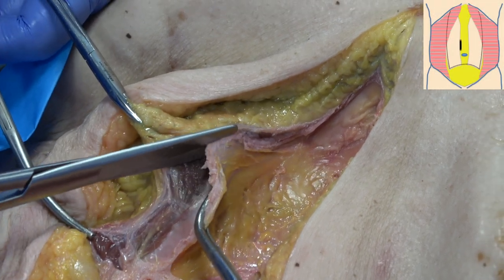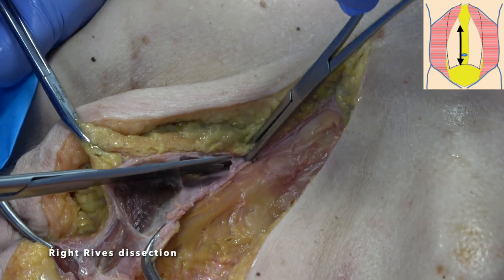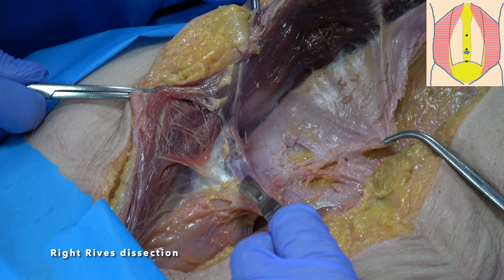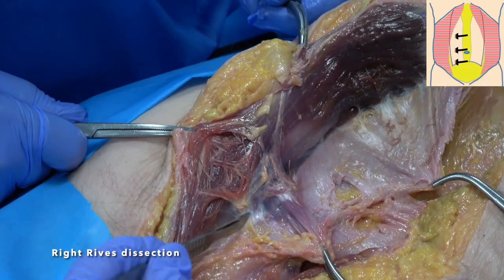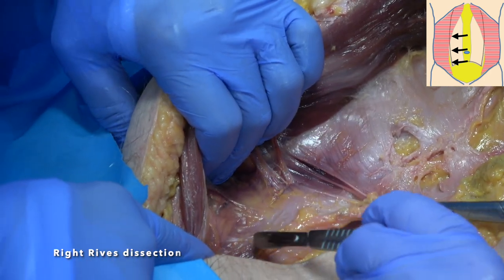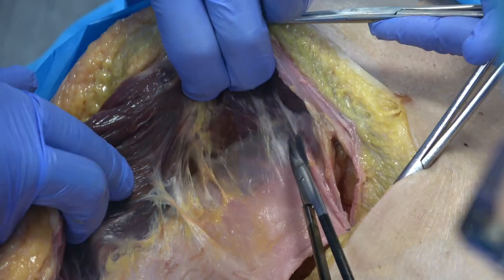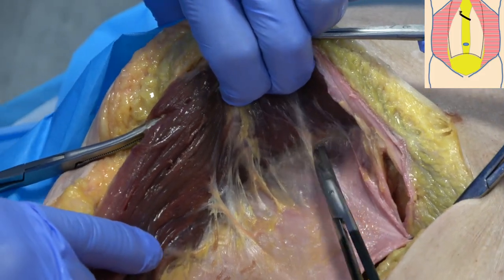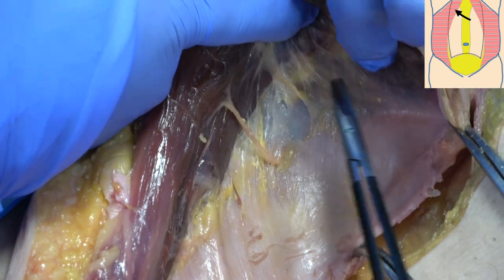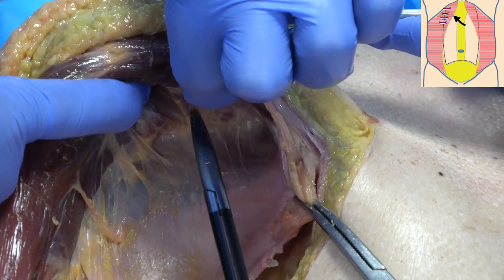The same steps are followed on the right side. The more medially we cut the posterior rectus sheath, the more we can take of the anterior rectus sheath and posterior rectus sheath for our abdominal wall reconstruction. Cranially, we insist on stopping the cutting of the medial border of the posterior rectus sheath and the retromuscular dissection about 6 cm below the xiphoid, and we don't dissect more laterally in this epigastric area.